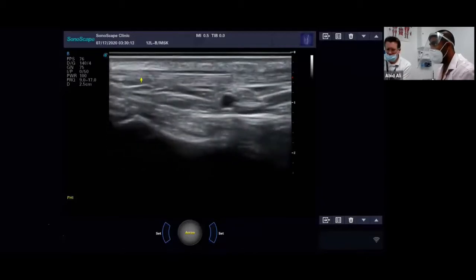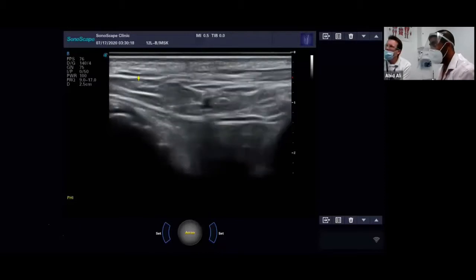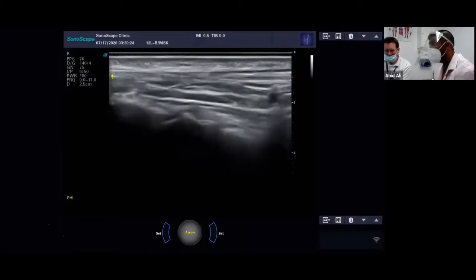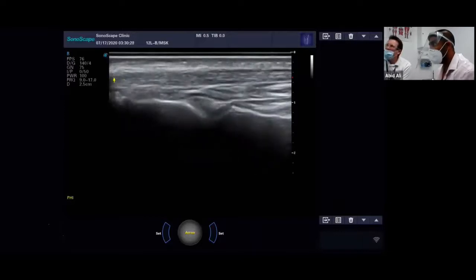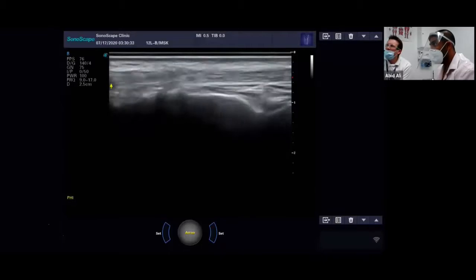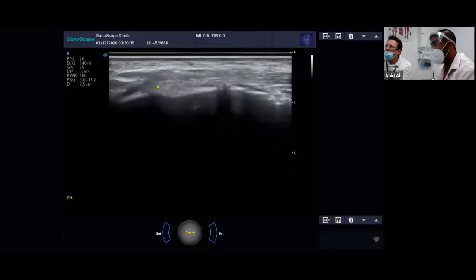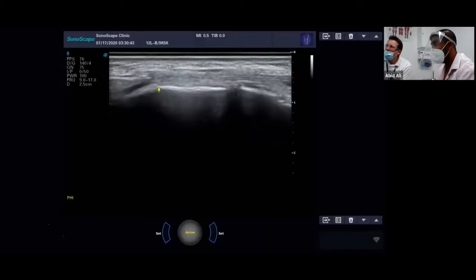So what you're going to try and do is keep the two ends of the probe on the tendon. So we're just going to follow it down and you'll start to see it thinning out. Just flex your foot a wee bit forward. And then obviously you need to know where it's going to go and insert to make it a bit easier. And now you can see we're heading down underneath the navicular. You see the fibres here, and there it's just going towards its attachment.